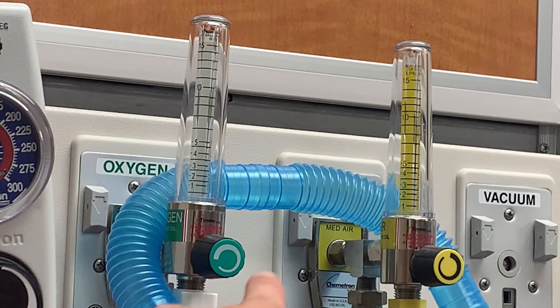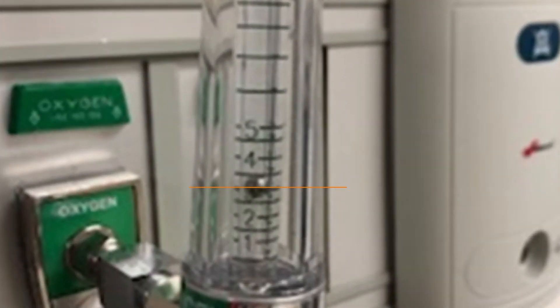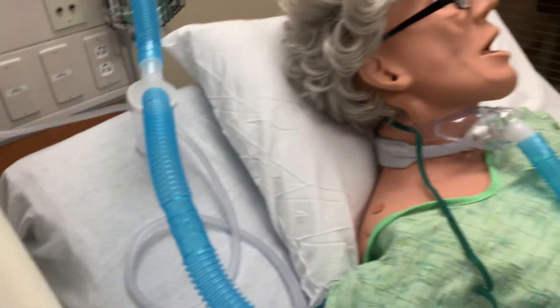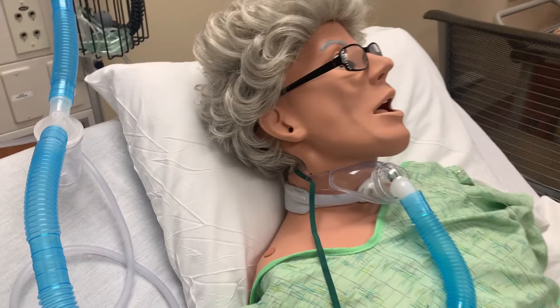To change the wall oxygen delivery, simply turn the knob on the wall unit. A small metal ball will float to indicate the amount of oxygen being delivered. The center of the ball represents the amount — do not measure from the top or bottom of the ball; always measure from the center. A hose is attached to the venturi setup that runs to the patient. Between the wall oxygen and the patient is a small canister that collects condensation before it reaches the patient. It should be positioned to hang below the hose so condensation falls into the canister.